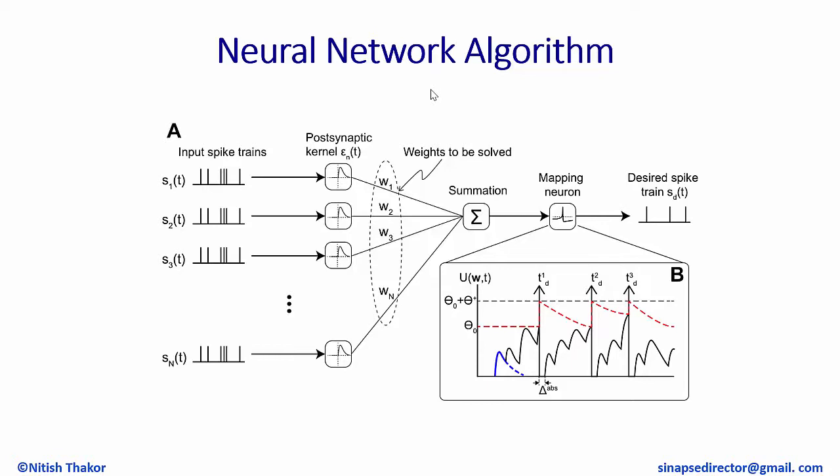By the way, I want to add one more thing. Why, you might ask, are we going to neuromorphic? Why all this spiking? First of all, it's digital, so that's great. Very good signal to noise ratio, an easy way to relate. But consider this: our body has millions of sensors. If we did this using conventional acquisition, we would be dealing with a huge amount of multiplexing and so on. But digital spiking activity can now be relayed, like we do in our nerves, in an encoded digital format.